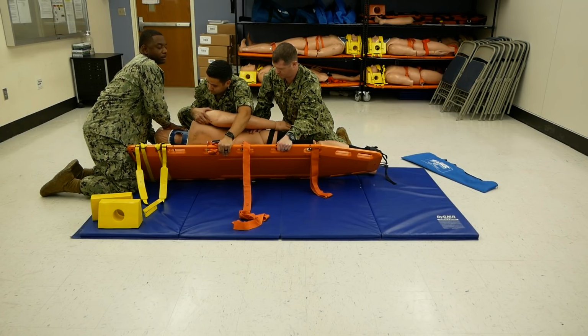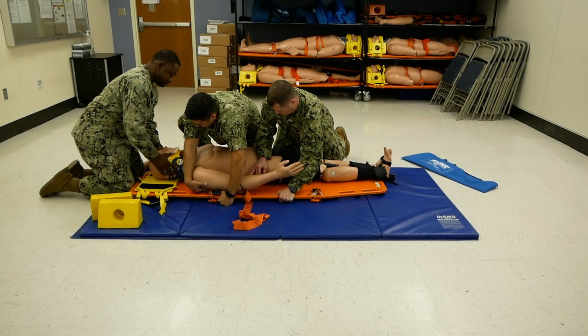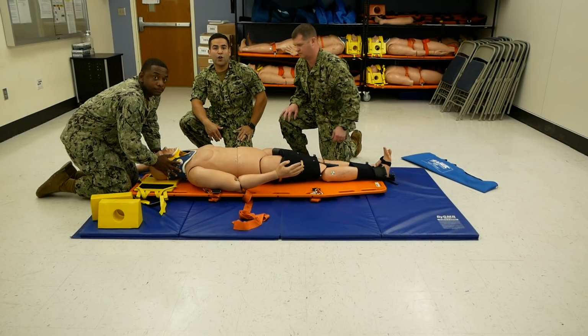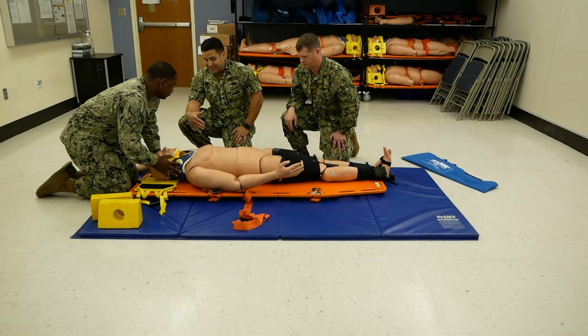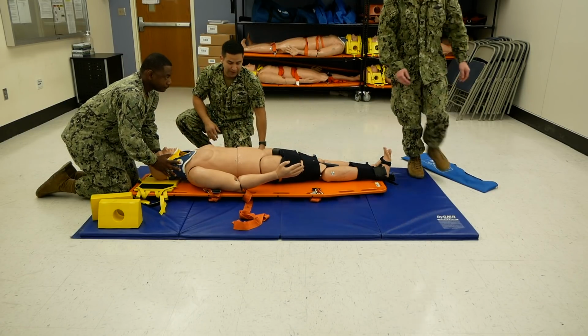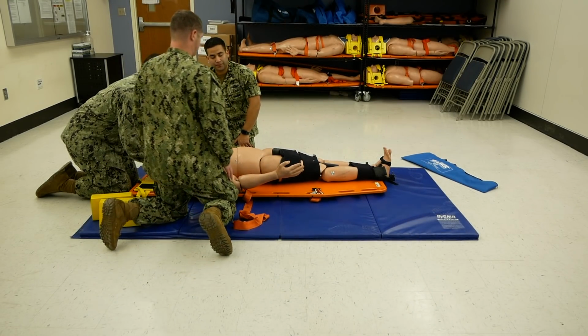All right, on 3. 1, 2, 3, roll. All right, now that the patient has been rolled on, we're going to use the V-slide technique to get the patient centered. V-slide technique, we want to move the patient down and towards the middle of the spine board. And then we move the patient up and towards the middle of the spine board.